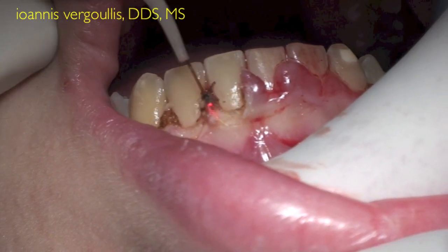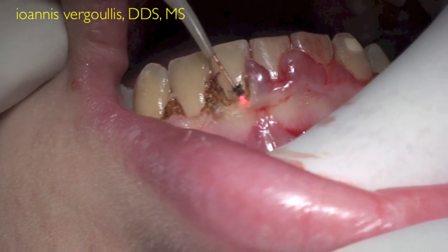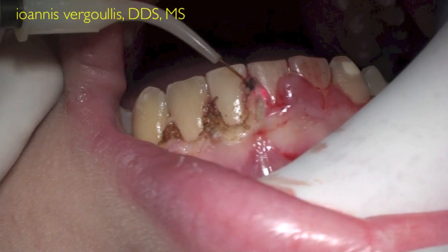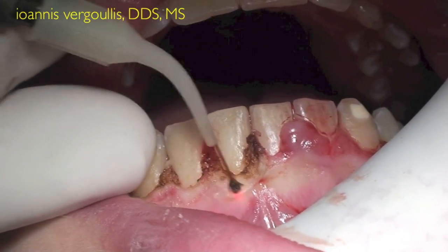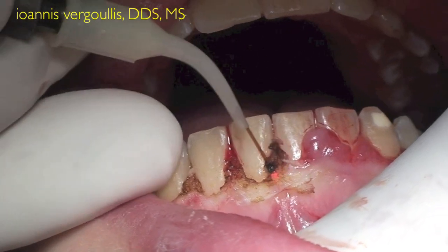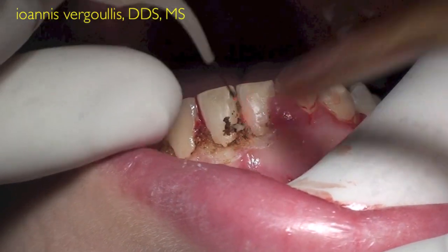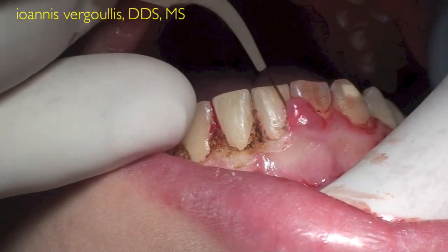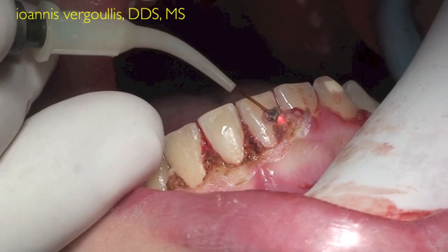Utilizing the laser makes the procedure take more time compared to using a scalpel. So you need to be patient. As you can see, we also de-epithelialize around the border of our free gingival margin, and this will allow better tissue adaptation throughout the post-operative healing period.